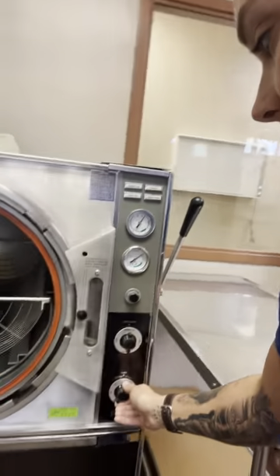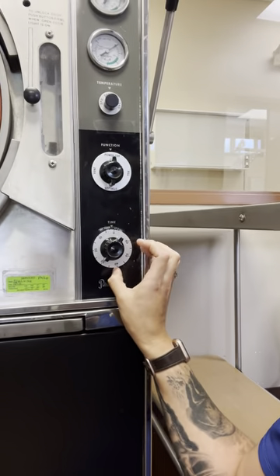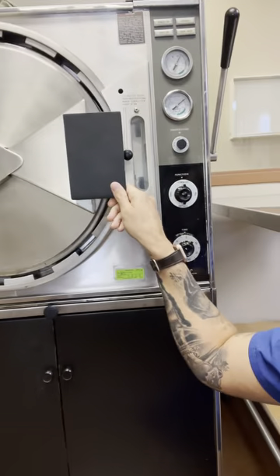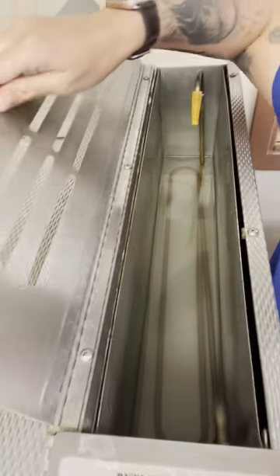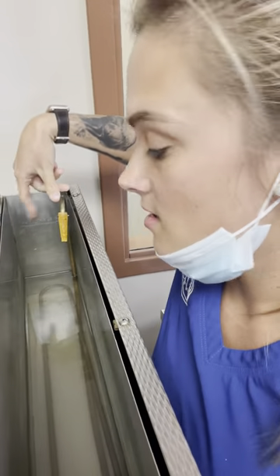You'll set the time button — we time ours for 45 minutes here, so you're going to set it to 45. You will close this up and pull this handle down and it's going to lock so you can't open it. Before you run the machine, always check in here in the mornings and make sure there's a line that says fill to this level, so you'll fill it to there.